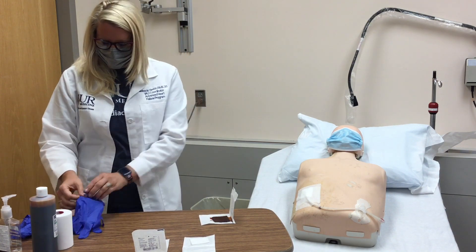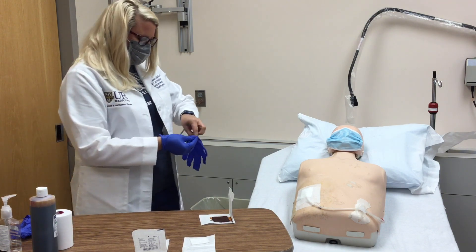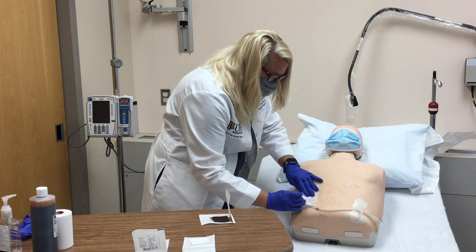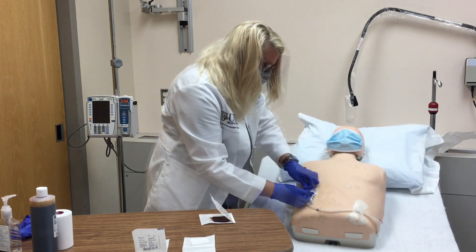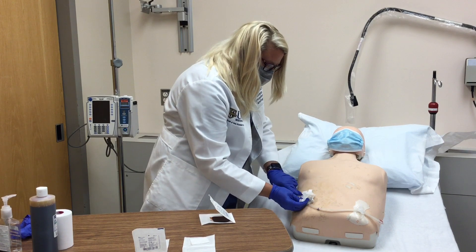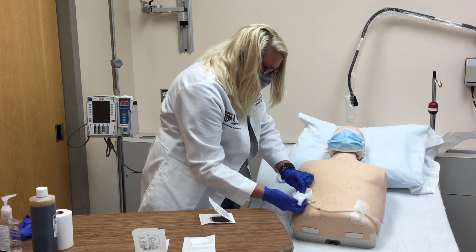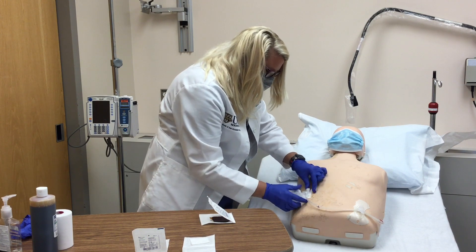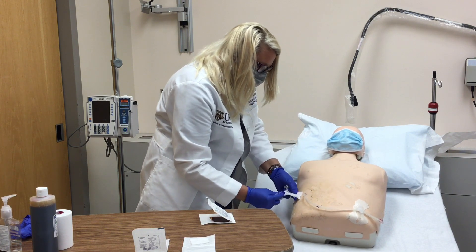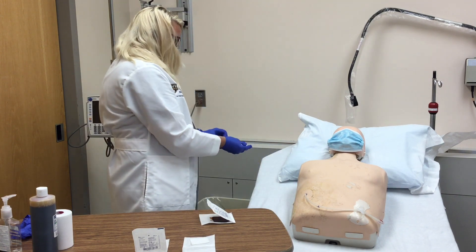Next, we are going to put on our gloves and loosen and remove the old dressing. Once the old dressing is removed, inspect the exit site for signs of infection. Discard the old dressing and remove your gloves.